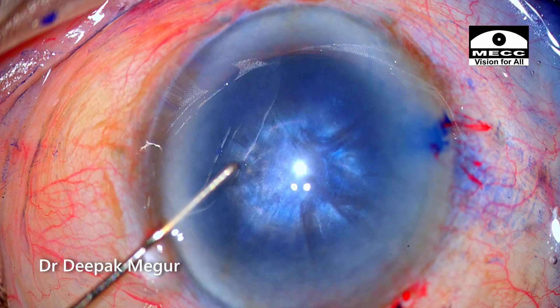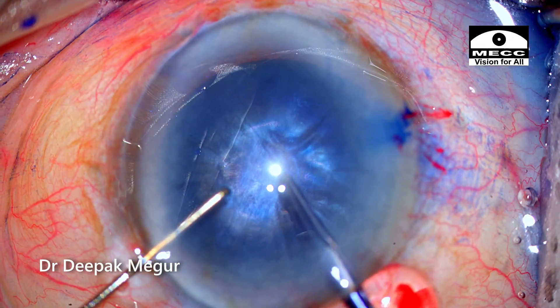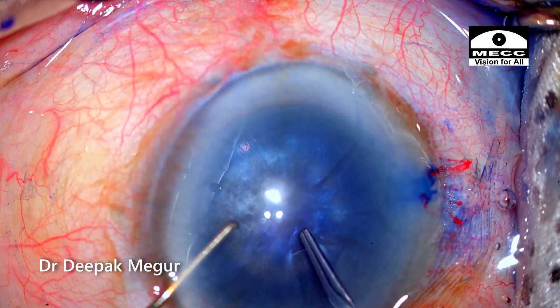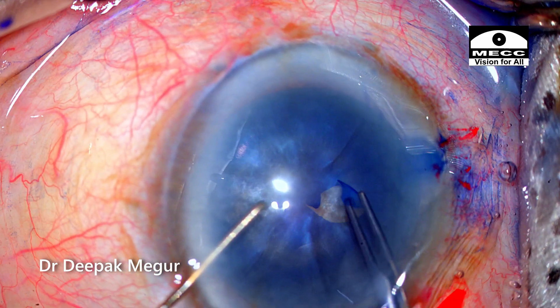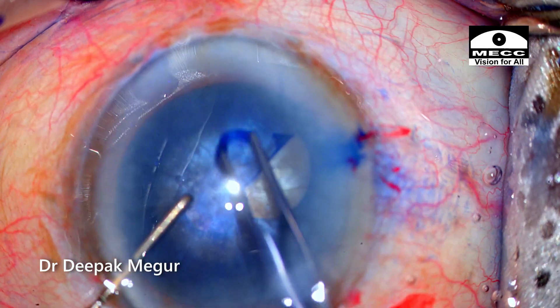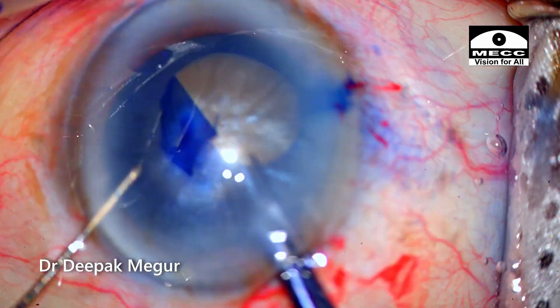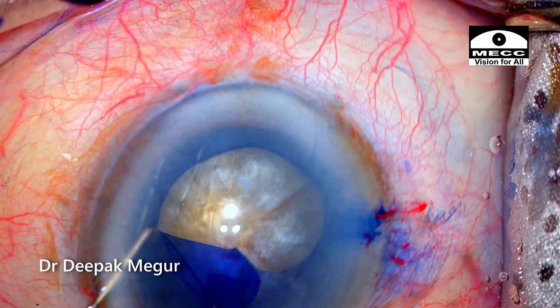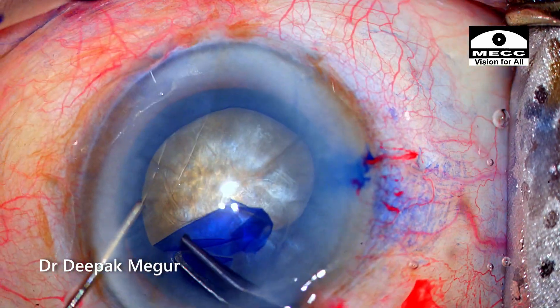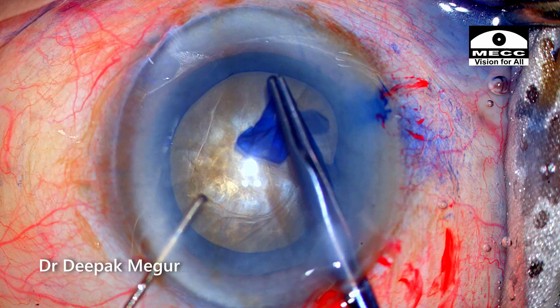Time to perform the rhexis. I am going in with my rhexis forceps. I puncture the capsule, raise the flap, and then begin tearing it. I am conscious not to create a very small rhexis since I am dealing with a slightly bulky and hard nucleus. My aim is to get a 5.5 mm rhexis.